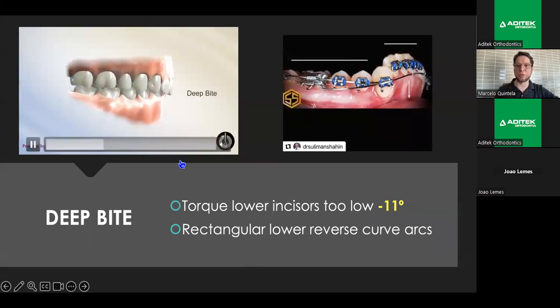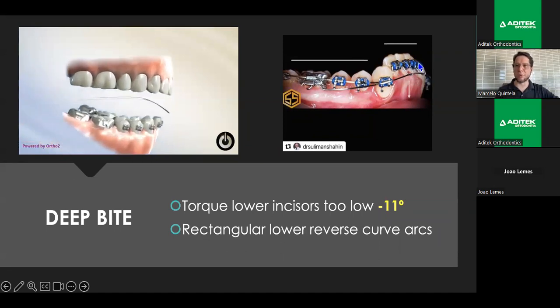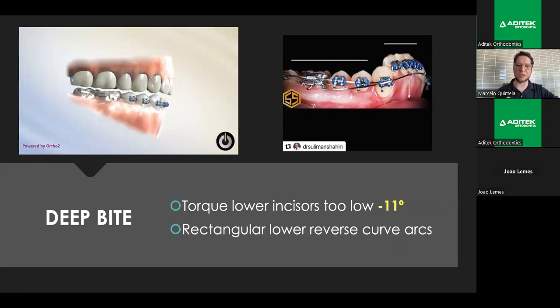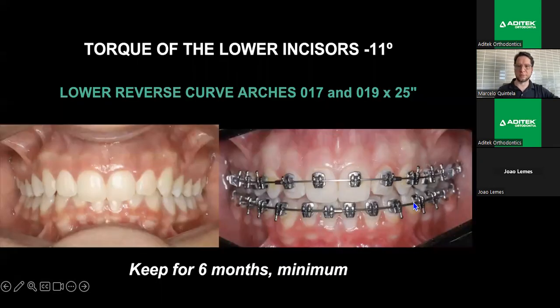But I prefer to use a reverse arch versus using utility arches or 3 arches together. It's not simple for me. I prefer the reverse arch because it is a straight-wire arch, a continuous arch. But it's dangerous. So minus 11. Look at that.